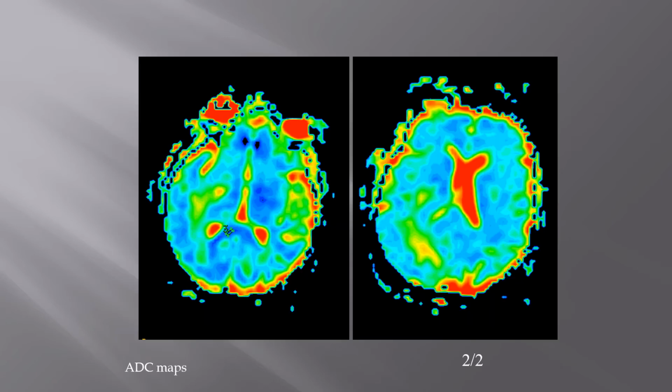Then to evaluate the ADC values, these are ADC maps. You can see it's a little darker here. Not a whole lot darker, but a little darker, so it is actually mildly restricted. Now, maybe it's not as restricted because maybe you have some edema mixed in. So things looking at lesions can get complex. Do you have increased cells? Do you have edema? Do you have necrosis? Do you have hemorrhage? So a lot of processes are going on. But this one would be very mildly restricted in its diffusion characteristic.